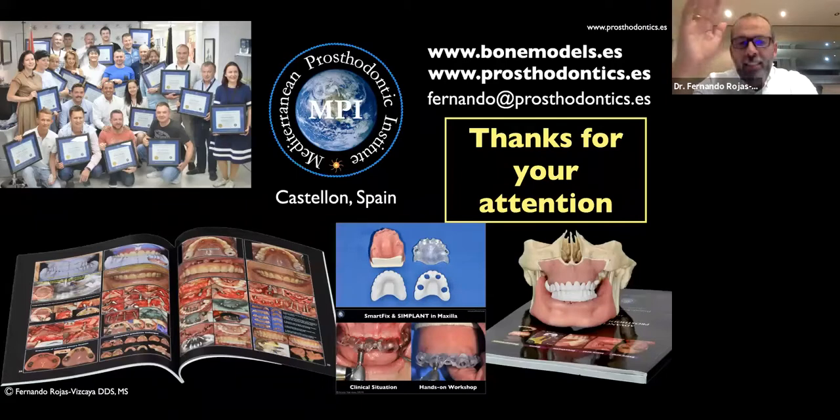In some cases, the technician adds pink ceramic in the palatal. Why? Because in the frontal view everything is perfect, but in the palatal direction he put a lot of zirconia, and to make it nice, he covered it with pink ceramic also. But I think it depends on the case. If you have flat interproximal areas, no big papillas, we can do thick monolithic zirconia. For me, it's working.